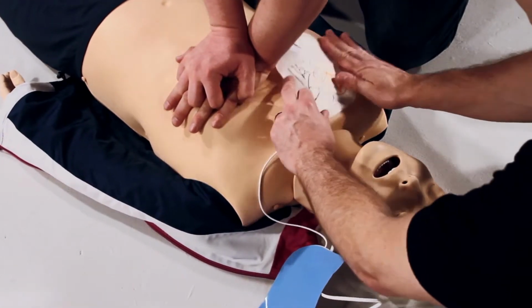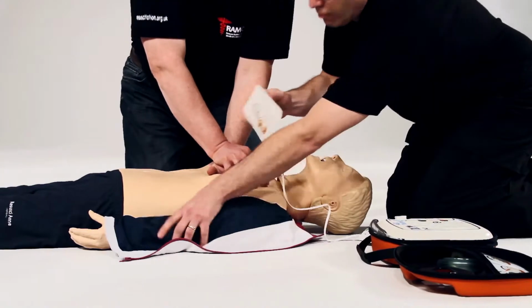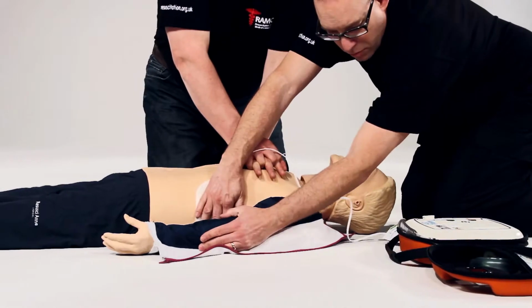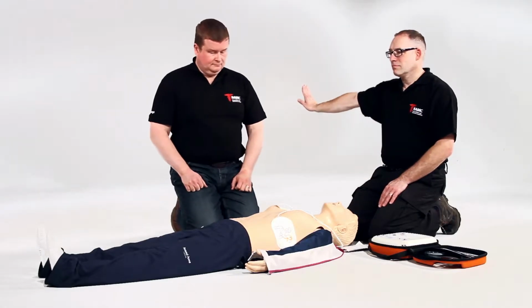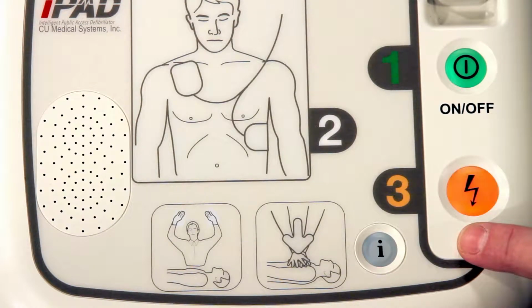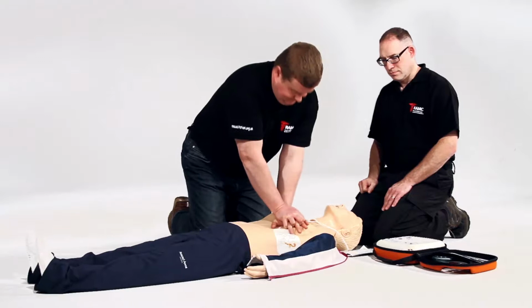Peel off the pad labelled 2 and stick to the bare skin of the patient, exactly as shown in the picture. Do not touch the patient. Analyzing heart rhythm. Stand clear. Shock advised. Stand clear. Press the flashing orange button now. Deliver shock now. Stand clear. Shock delivered. Carry on. Begin CPR now.